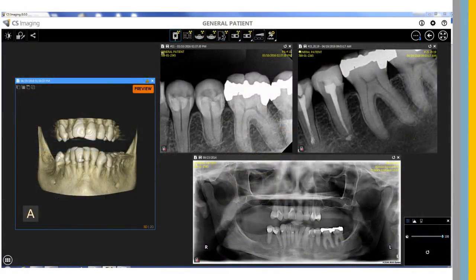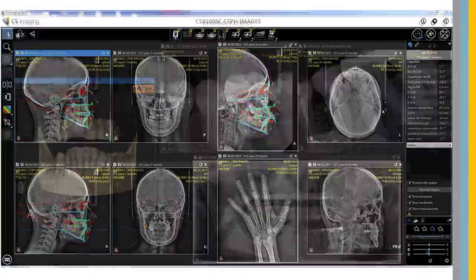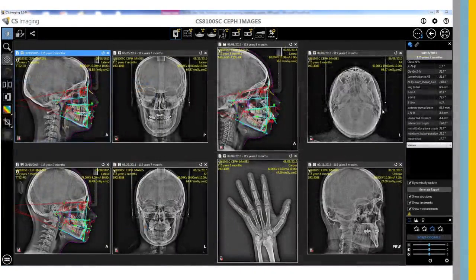This provides an improved workflow for the practice staff. The updated image workspace has many new features. When the workspace is opened, images are automatically sized and grouped for an optimal view. The new auto-arrange function provides faster and easier multi-image review using fewer clicks.